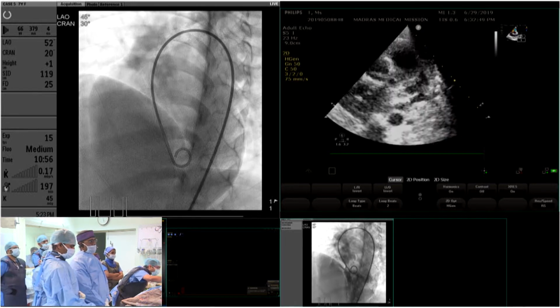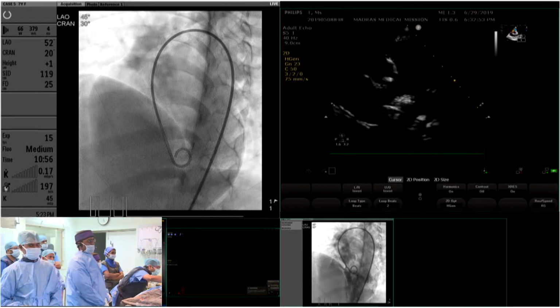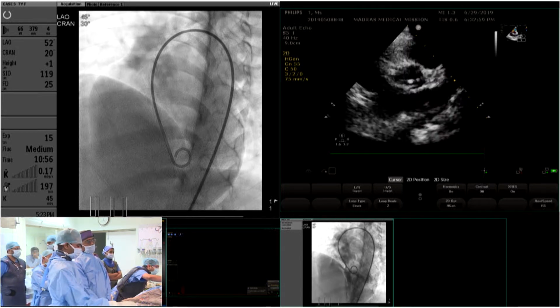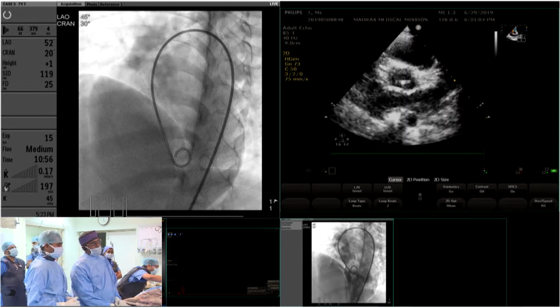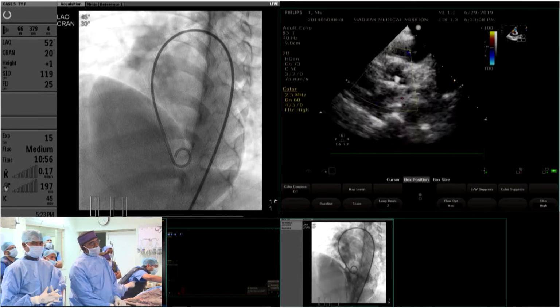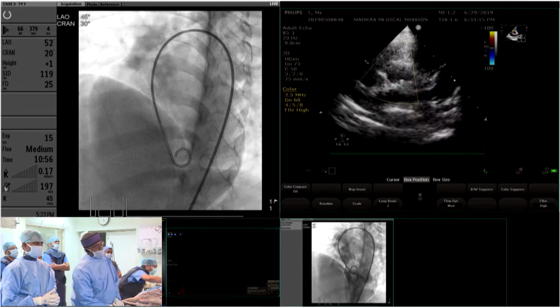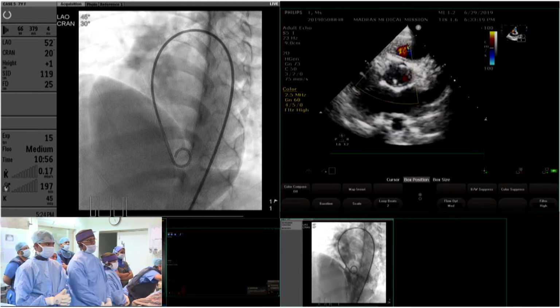Jesse, do you feel we have all the information? We need some more. What else do you need? Siva? Yes. Would you be using transesophageal or transthoracic? The normal practice for us in our cath lab is to use only transthoracic echocardiography with sedation using a combination of ketamine and midazolam. And we don't employ transesophageal echocardiogram usually in our perimembranous VSD device closures at all.